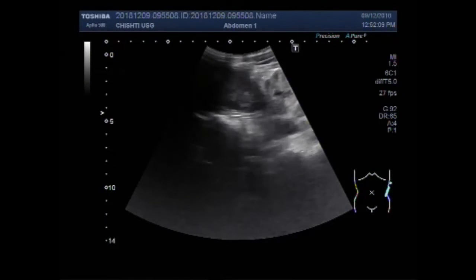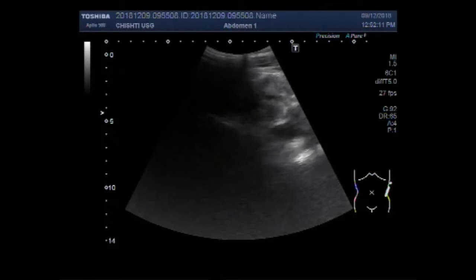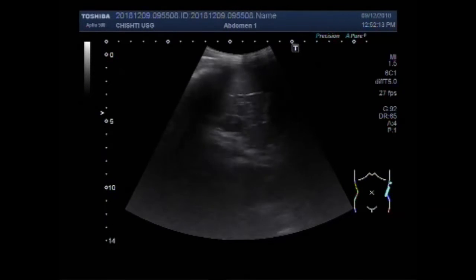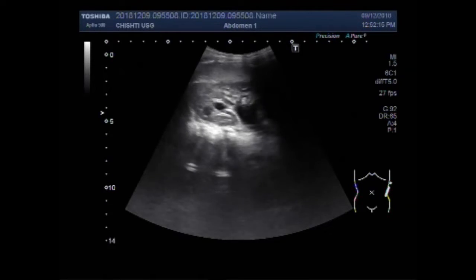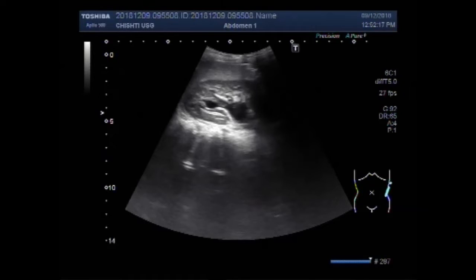Dear viewers, I hope you are all fine. This video shows a small ureterocele.